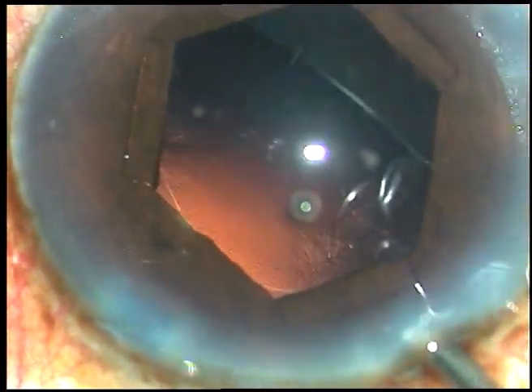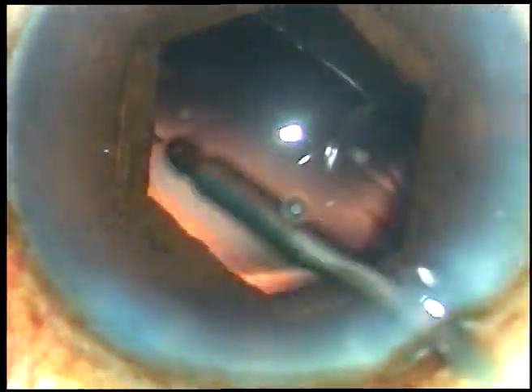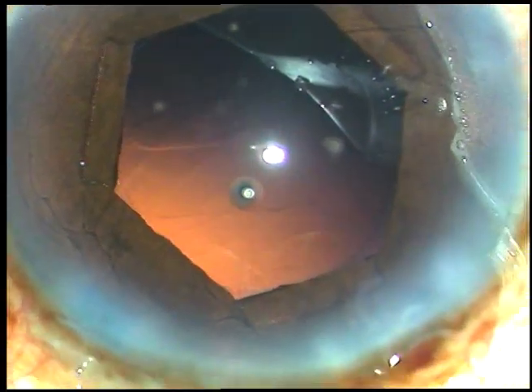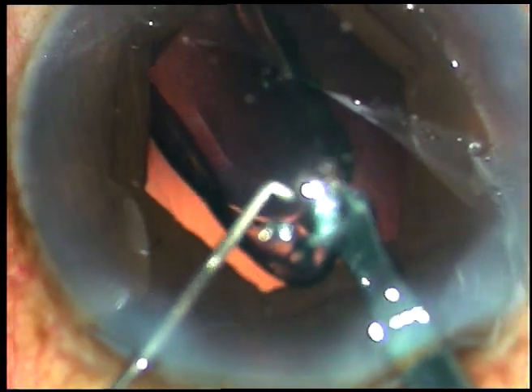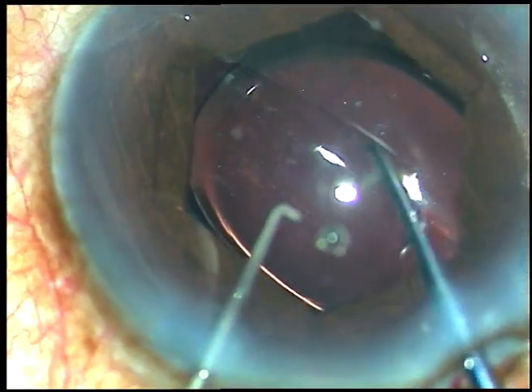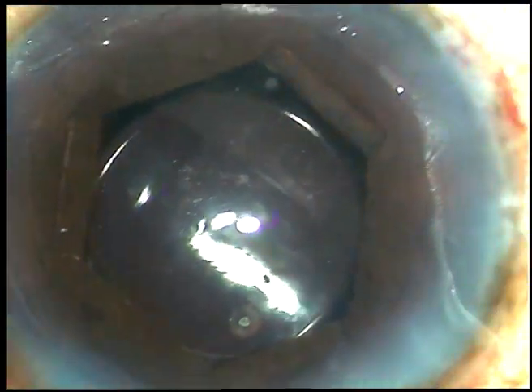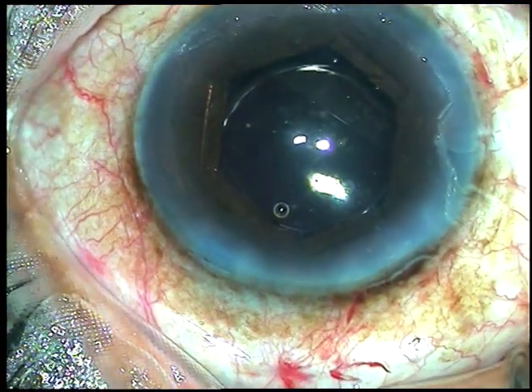Now I am going to use the irrigating probe to do hydro polish — polishing with a jet of fluid. This is a very nice way of polishing the posterior capsule. Now I inject viscoelastic substance. In this case I am going to use a monofocal intraocular lens — it is Tecnis single piece, Tecnis 1 intraocular lens. I am going to dial the lens and place it in such a way that the haptics are in the horizontal position.